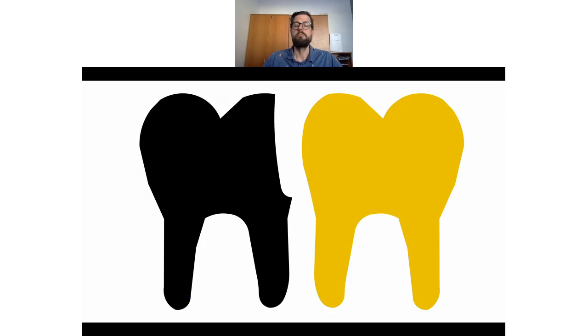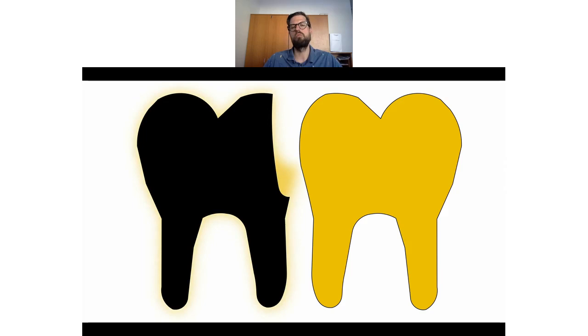So look at this case. Normally, when you put the matrix inside and you go with the wedge from the side, it will be like this, because the wedge will push the partial matrix into the tooth, and you can make it like this, no problem. But food will go there, and also you will have inflammation in the interproximal area. So normally you should do it like this. First, you will do the margin elevation. In the first step, you will elevate, and then you can put the partial matrix there, and then you can wedge. And now you will have a result that is really nice for you and also for the patient.